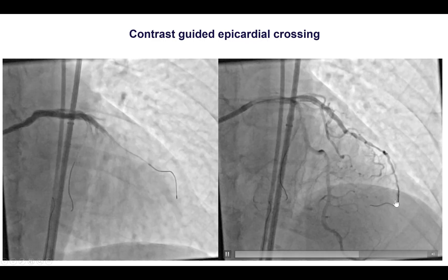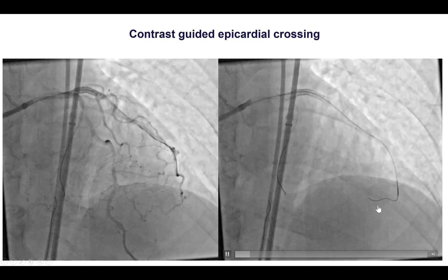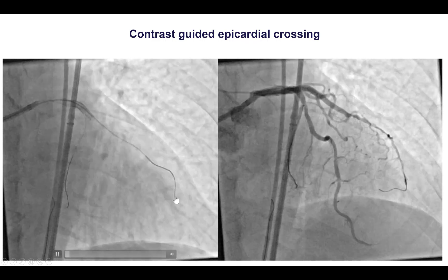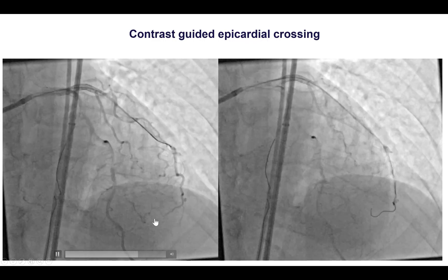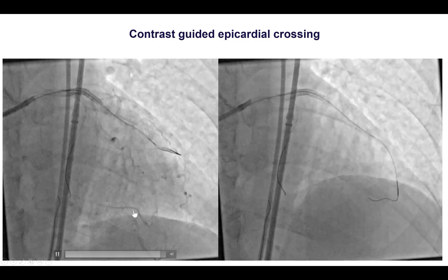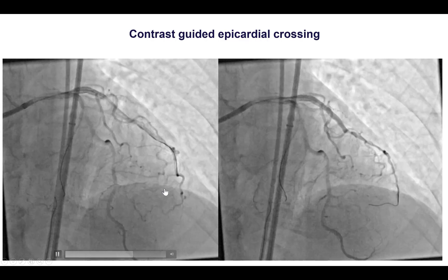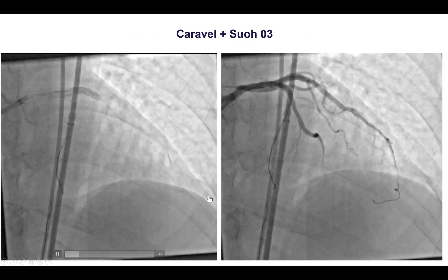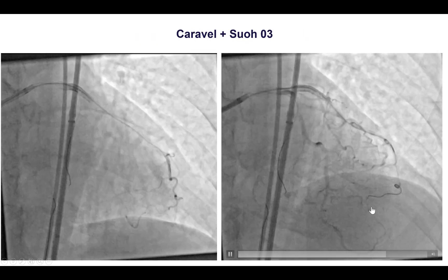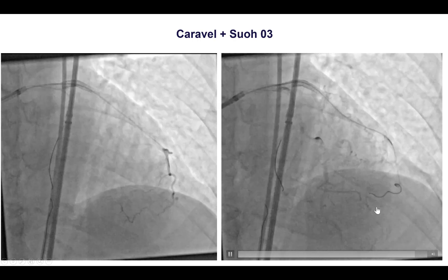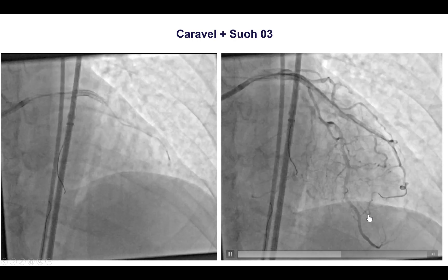We inserted the Caravel microcatheter and a Suoh 03 guide wire. As you can see, it's a very tortuous collateral with multiple bends, although it wasn't quite as bad as the epicardial coming from the acute marginal from the right. The Suoh 03 wire took the first bend, but then had quite significant difficulty negotiating the second set of bends.